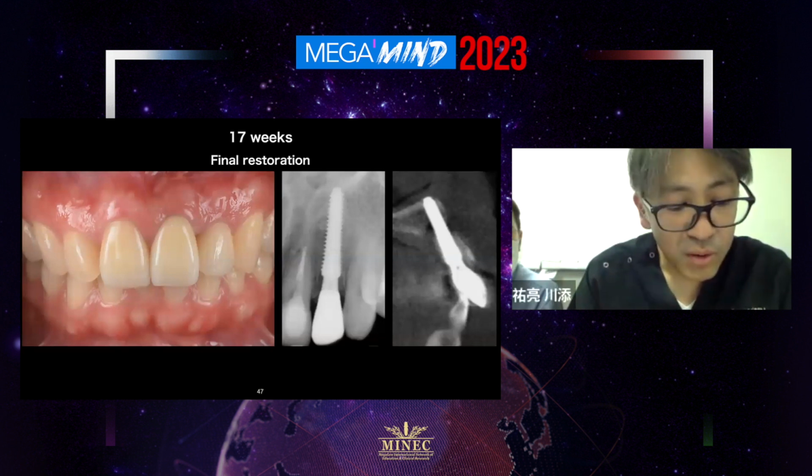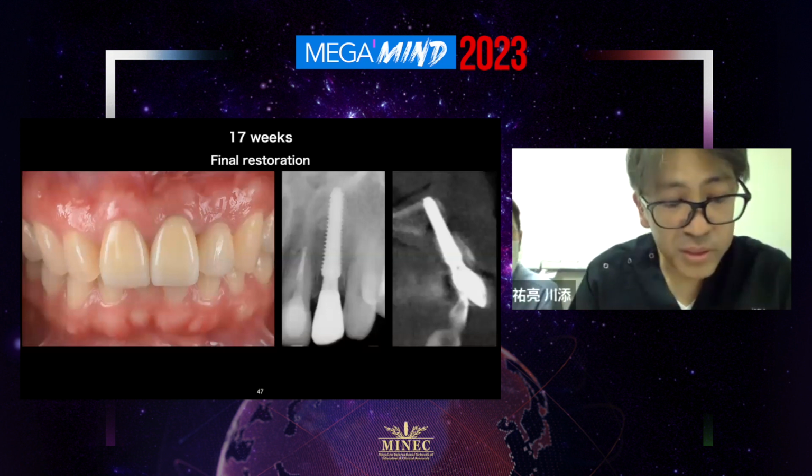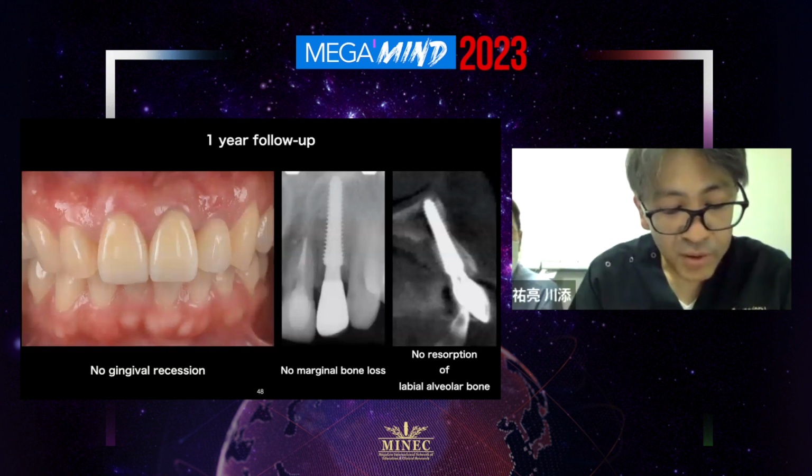There is no alveolar bone resorption on the labial side, and a good result was obtained. No marginal bone loss, labial alveolar bone resorption, or gingival recession was observed at 1 year.